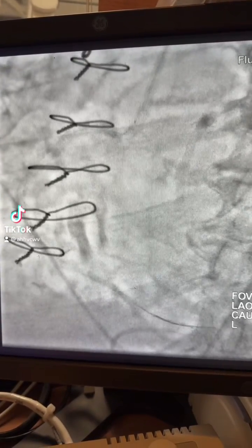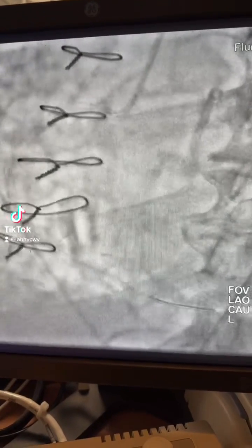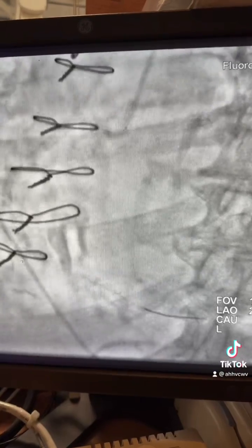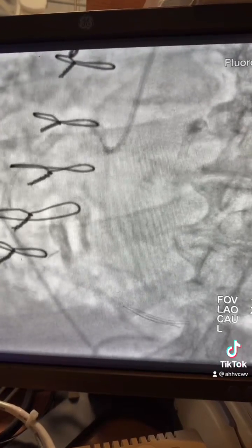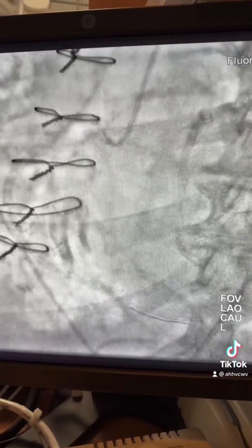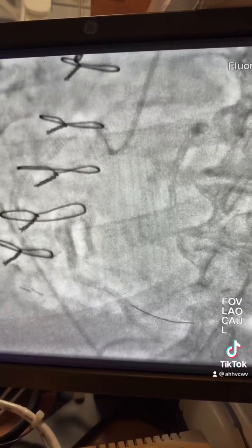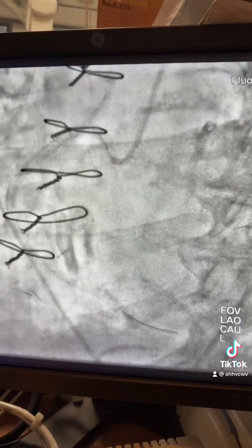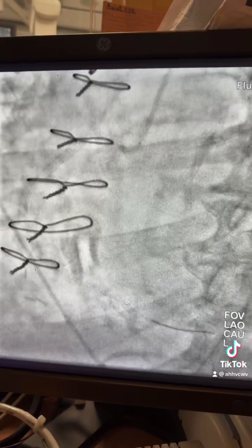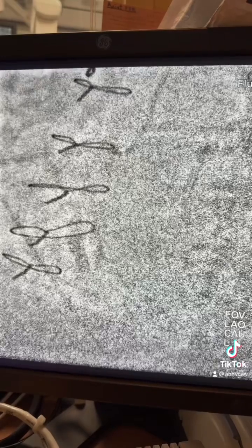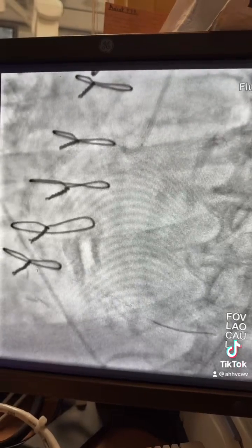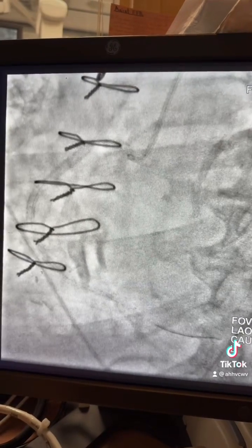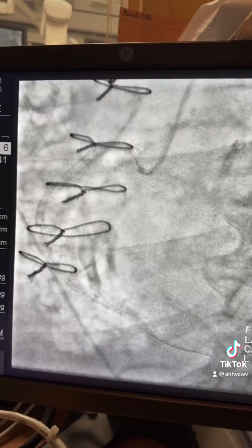A fast teaching point for today — a trick during the heart cath and intervention: when you have an ostial RCA lesion with an ostial stent and couldn't pass the balloon or the stent, like in this case.